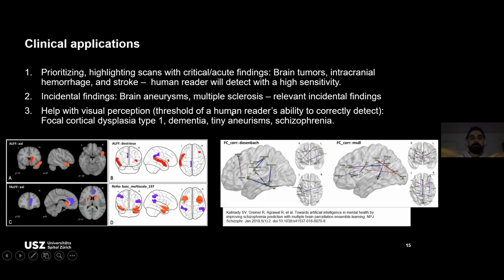So basically, if we look at clinical applications, they can be divided into three categories. First, like I said, in stroke imaging, when it is not a problem to detect a lesion, it is very welcome that we have a system that would provide us very quick and reliable assessment options in patients in order to maybe enhance the process of treatment.